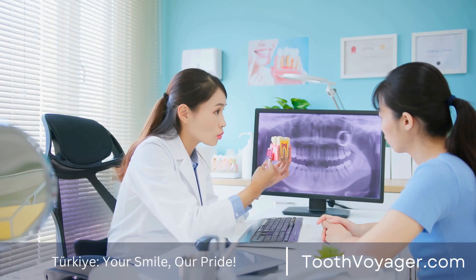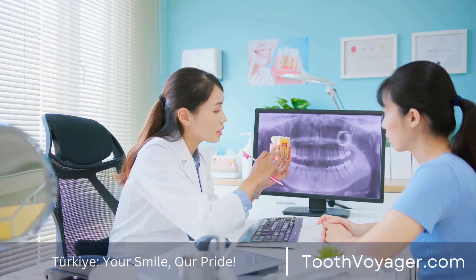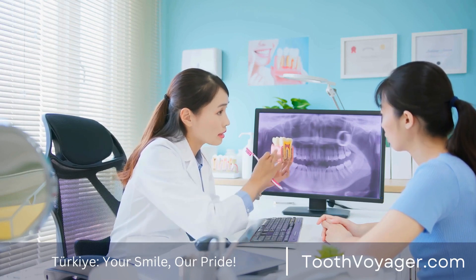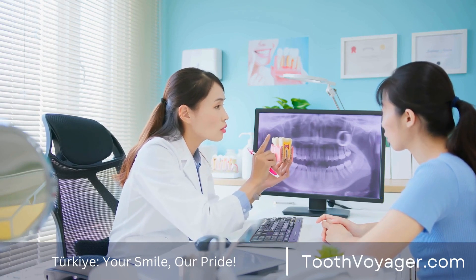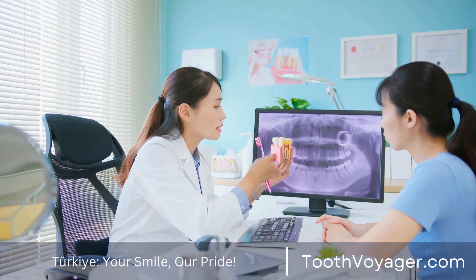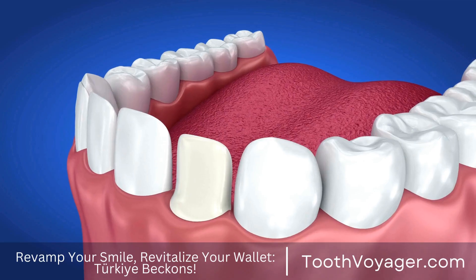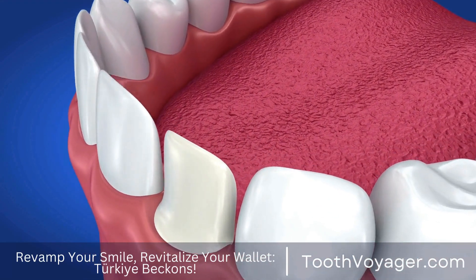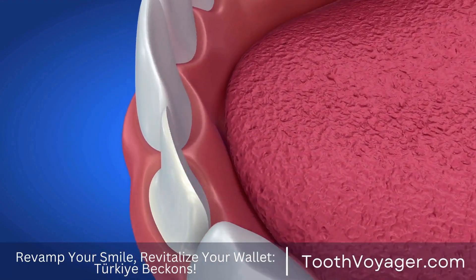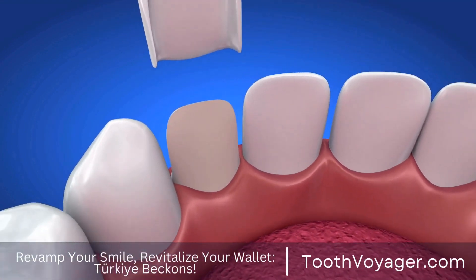The cantilever bridge is used for cases when there is only one natural tooth adjacent to the gap where the missing tooth previously was. The false tooth or teeth are fixed to a crown that is attached to the one natural tooth next to the gap.